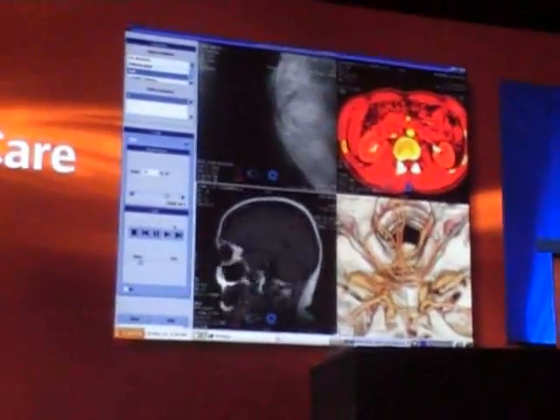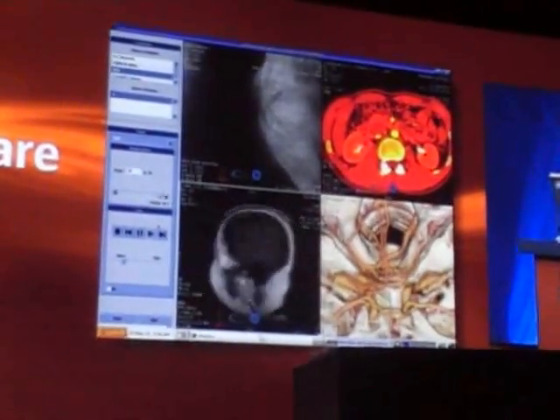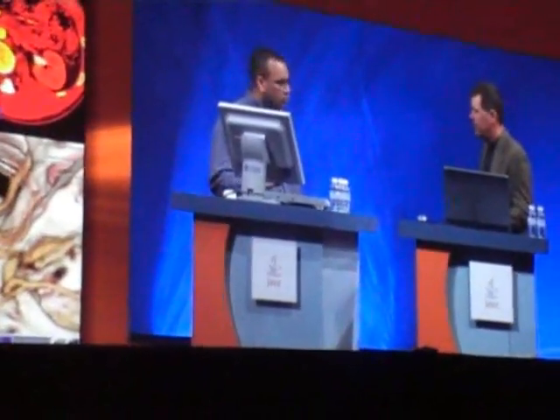We want to push this technology into more and more applications that we ship out of GE Healthcare, and be able to increase our presence in hospitals, not only ours but also Java. I'd like to emphasize that this technology saves lives and makes a difference in people's lives on an everyday basis. These are the tools that doctors use to detect any one of our family members' conditions, whatever their illness might be.